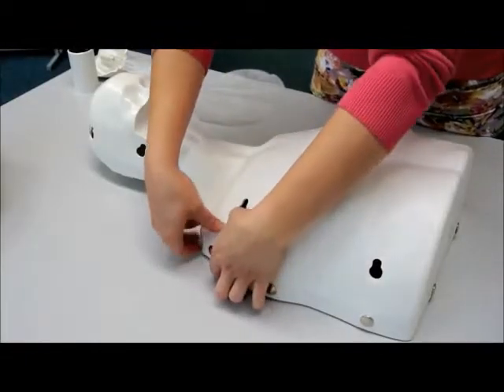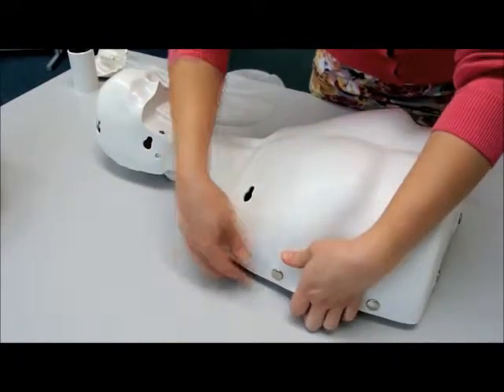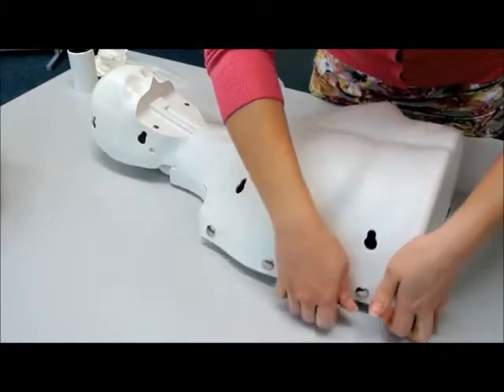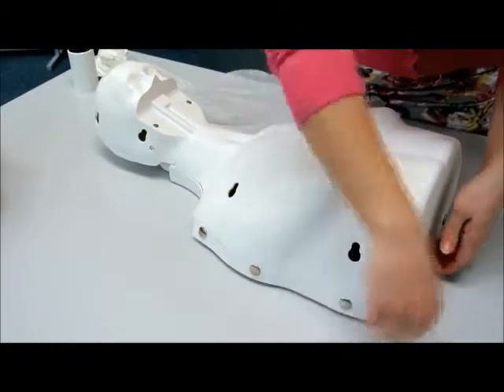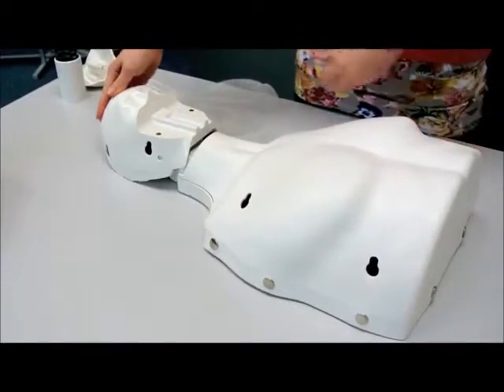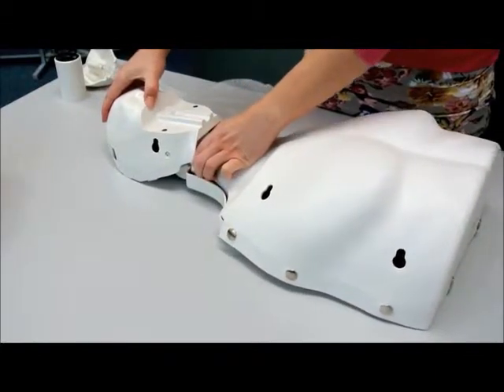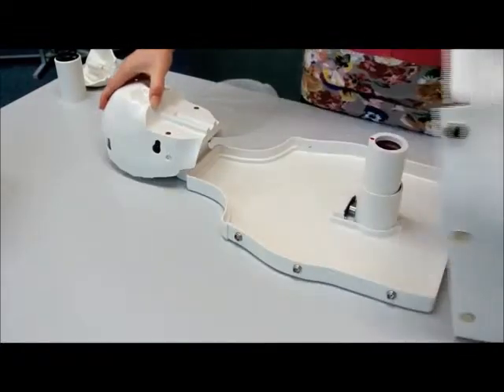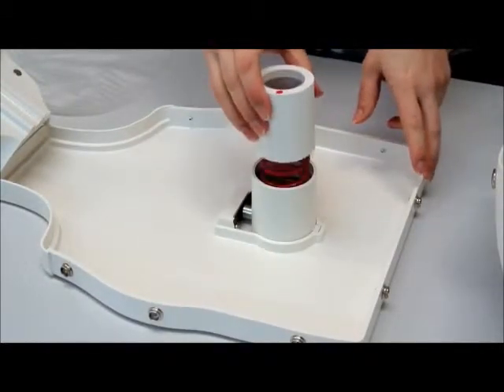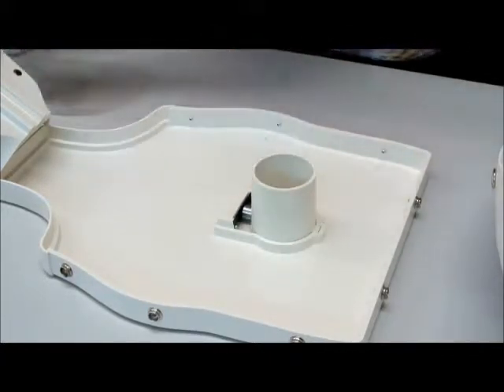Changing the compression spring allows for child mode. Once the thorax skin, face skin, and lung bag have been removed, the thorax cover can be detached and removed. Tilting the head back will make it easier to remove the thorax cover. The compression springs can easily be changed — red for adult and green for child.